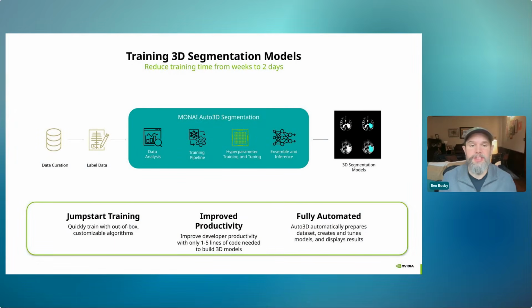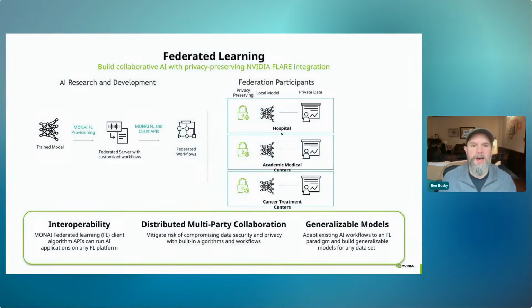I mentioned segmentation models before. This is a really nice thing. We can train segmentation models quite easily using the Monai framework. And in my personal opinion, we're all moving towards federated learning. Monai integrates with another framework that NVIDIA supports called NVFlare.